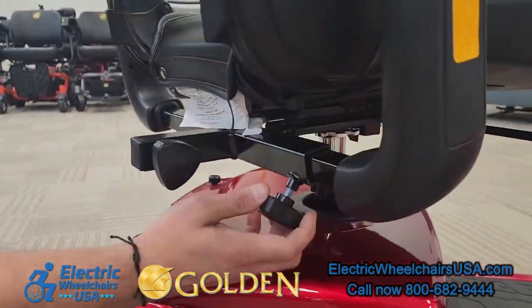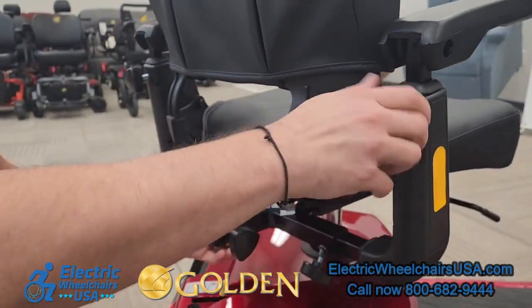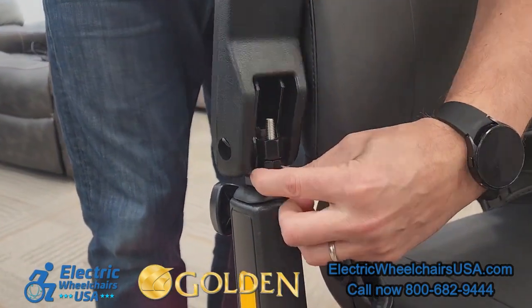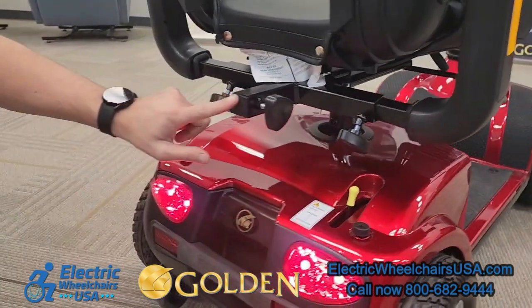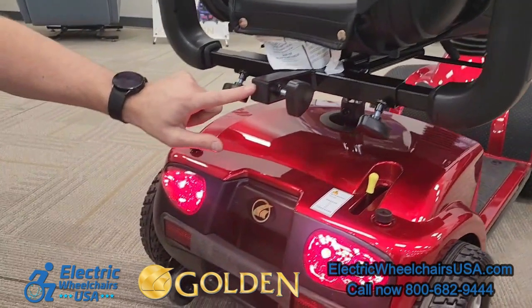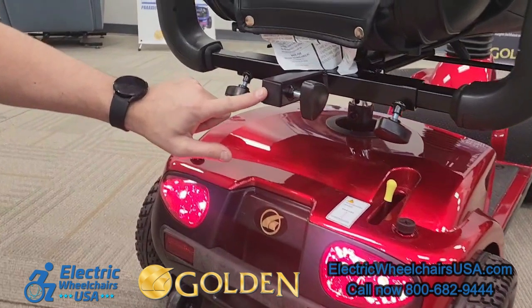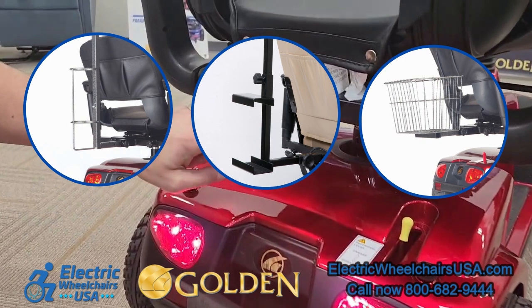On the back of the chair, the armrests are width adjustable, height adjustable, and also angle adjustable. There's a universal accessory hitch on the back. You can see the accessories we have available — just go to our website to see the types of items you can add, like a rear basket or an oxygen tank holder, for example.